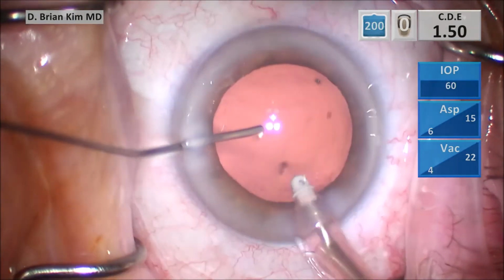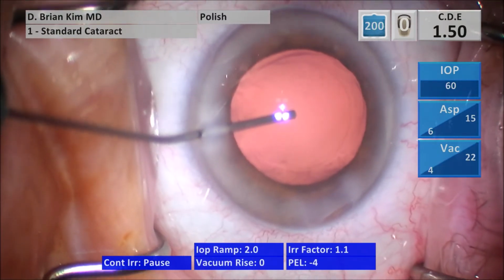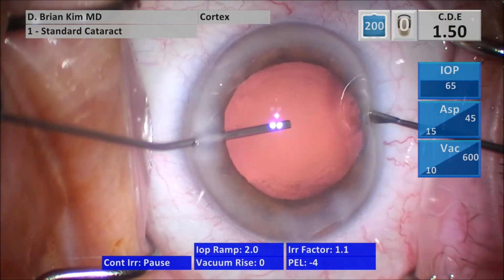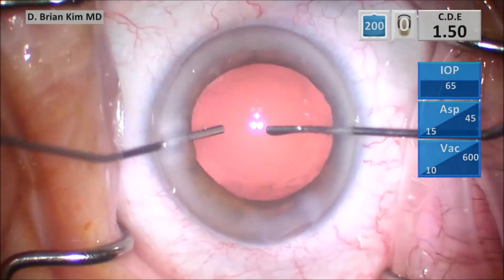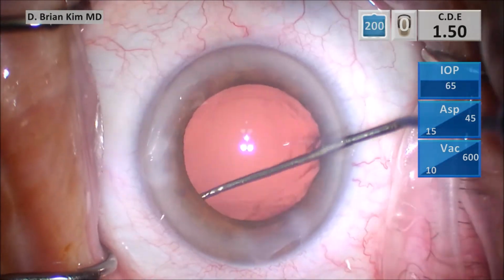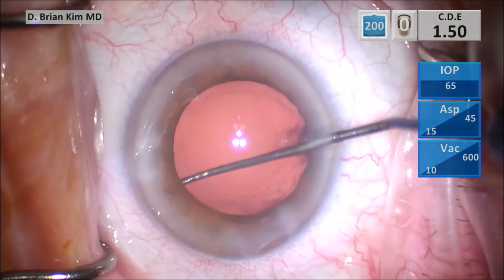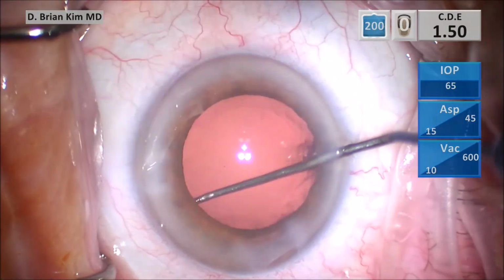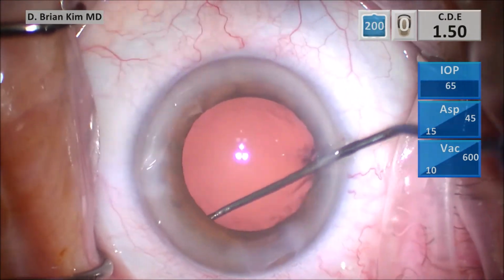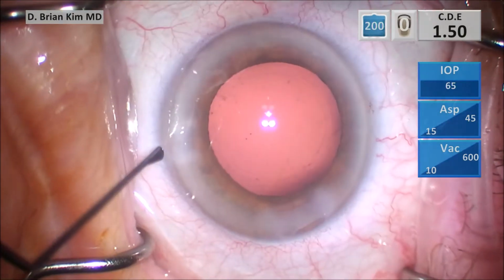And then this is some cohesive viscoelastic to fill the bag. And I quickly transition to the sweeper, polishing under the rhexis edge. First on the left side. And then on the right side.